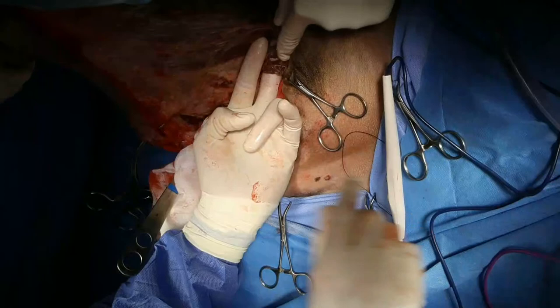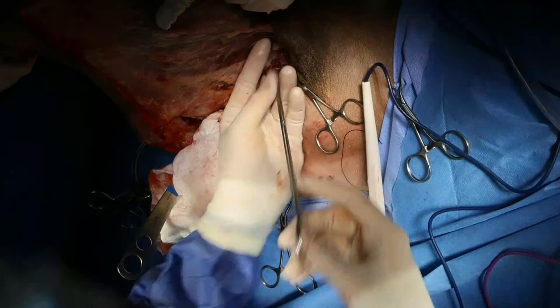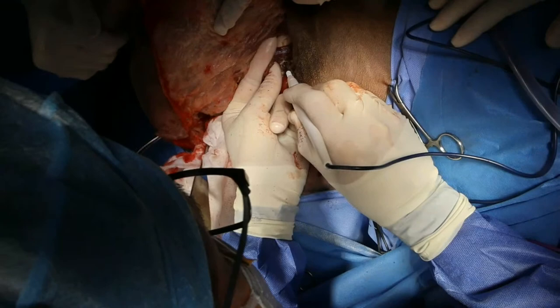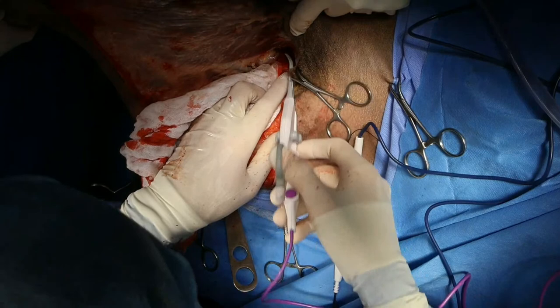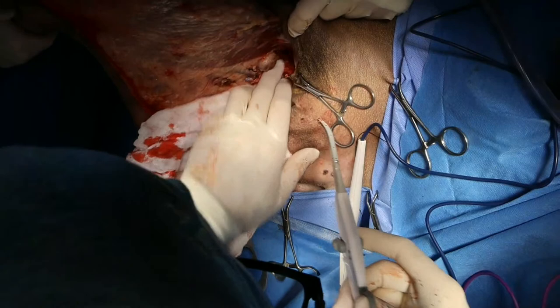So just transect that. Now there's a lot of work done in humans about avoiding neuromas by reimplanting the nerve in a muscle belly. Still stimulating that femoral nerve, the distal branches. All right, so a little bit of bleeding in here, not much. So that's going to be a branch of the iliolumbar vessel. That's the big vessel that you can hit inadvertently when you're cutting the ilial wing. That looks pretty good, though.